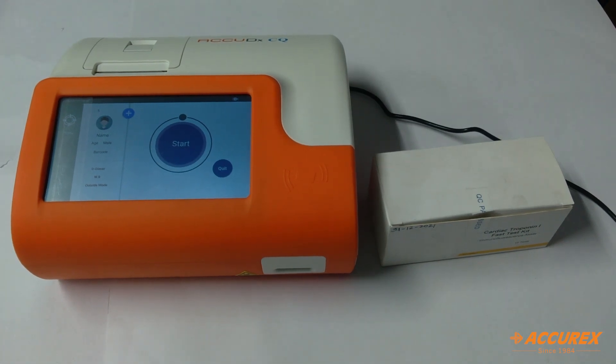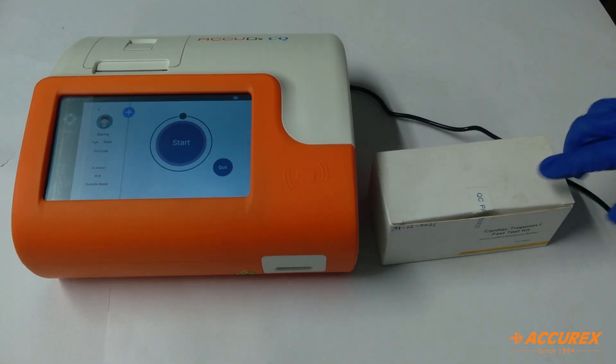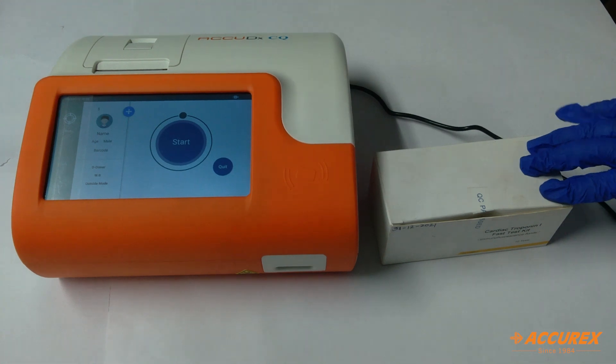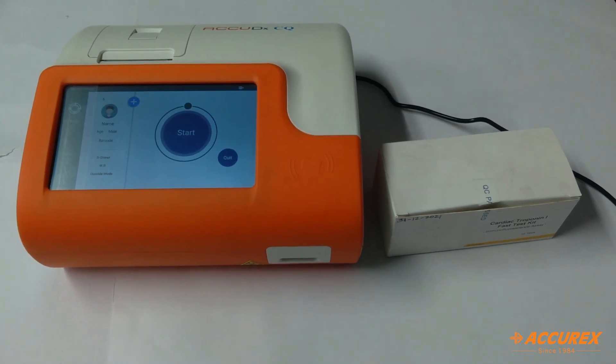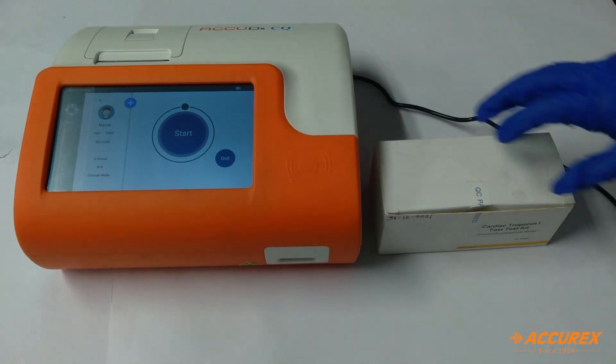Hello everyone, greetings of the day. Today we'll see the cardiac troponin I fast test kit. This is used for measuring the levels of troponin I — the troponin I protein in the body — which is released due to some damage in the heart muscles. Now we'll see how to test this.